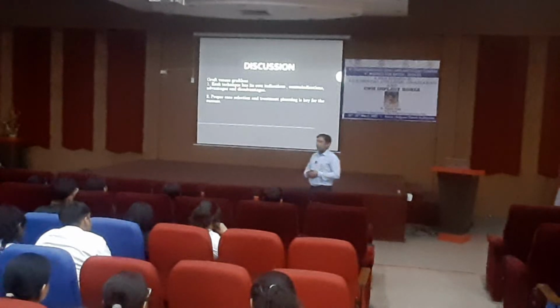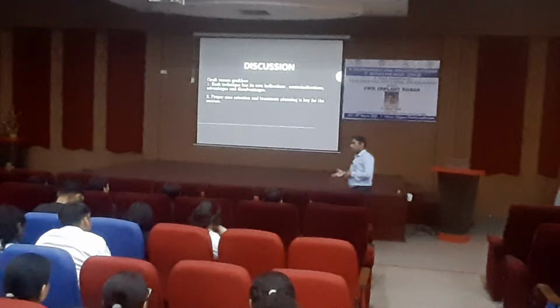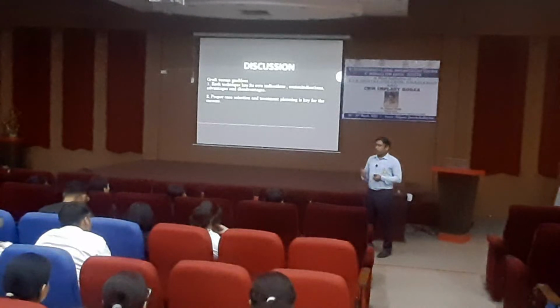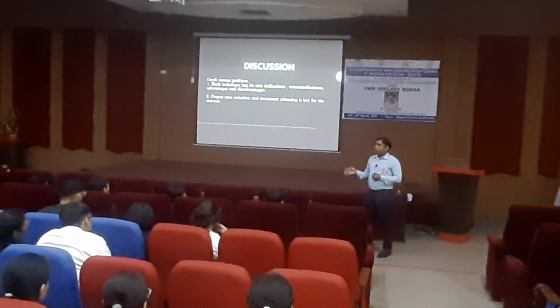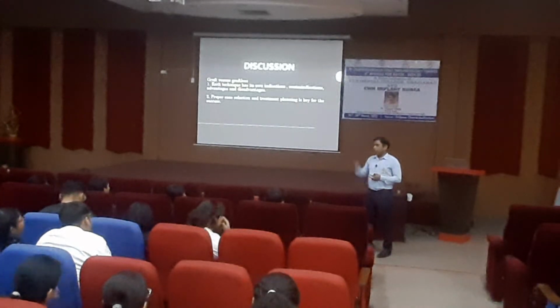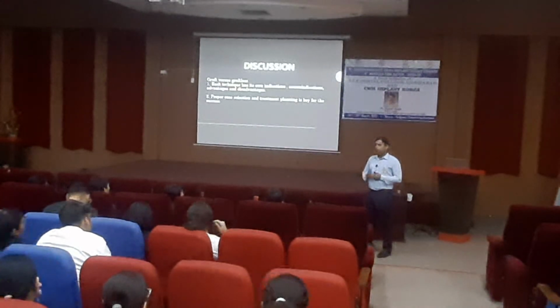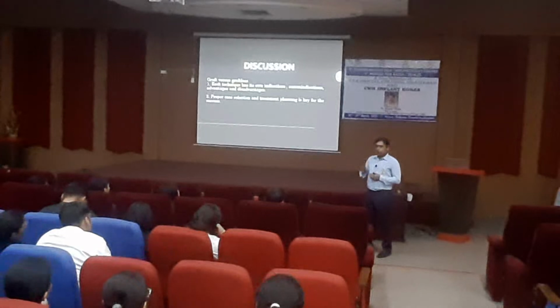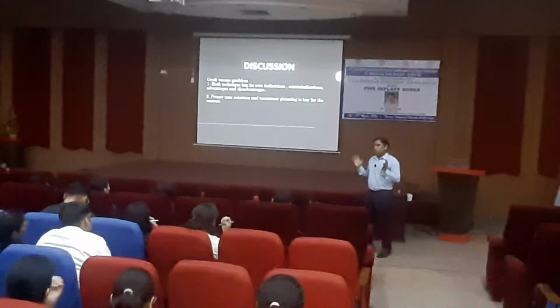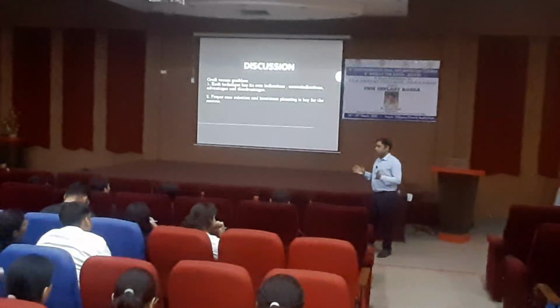ठीक है, sometimes patient is not ready for the grafting procedure, then definitely all-in-4, all-in-6 zygomatic is the best treatment option. But if you want a long-term result in these type of atrophic jaw, you always go for the grafting first. Okay, for example, in this case, if you are going for the sinus lift and putting some bone graft and placement of the implant after the 4 months, then we put more straighter implant as compared to the tilted implant.